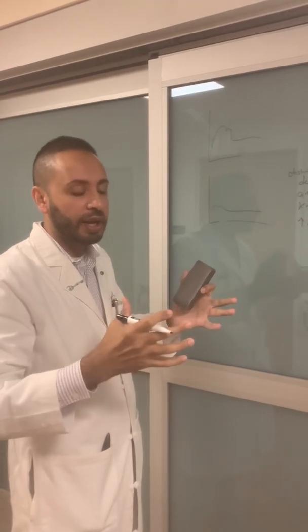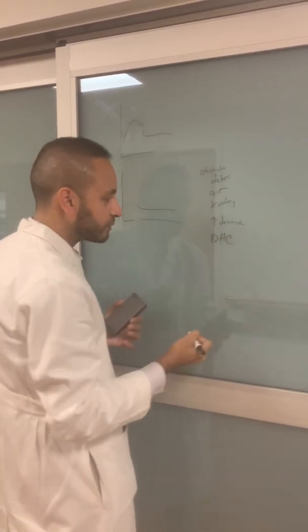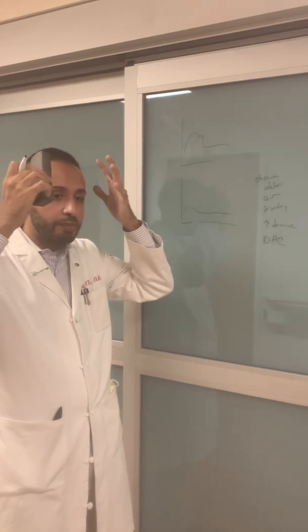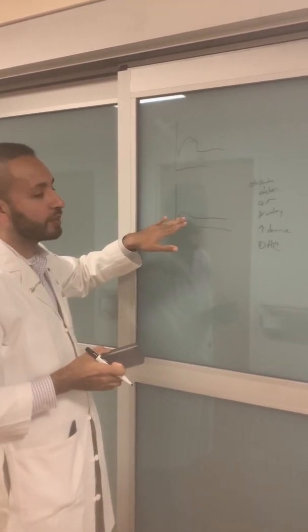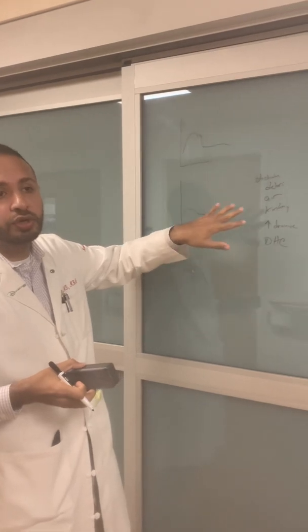There's more room in the brain because you have now drained CSF, right? Another thing that's going to decrease the amplitude is a DHC, right? When you take the skull off, the brain doesn't have that thing bouncing against it, so the pressures are going to be much less pronounced. So it's very normal to have a depressed waveform in the unit, all right? And these are sort of the reasons what could cause them, all right?